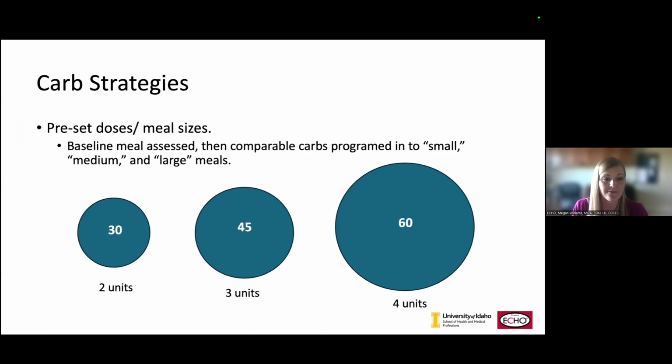And so even if they're just, and you can see I'm doing a 1 to 15 insulin to carb ratio as an example here. But if they even put in something, it's going to prevent a higher spike and they get into the habit of doing it. That's more important to me than the accuracy of it. And I tell them that straight up. I don't care. Put something in and we'll get there.